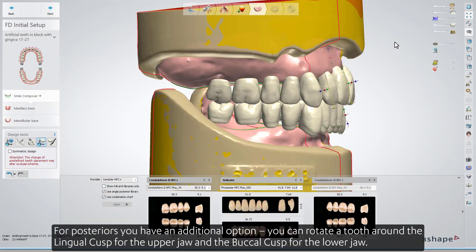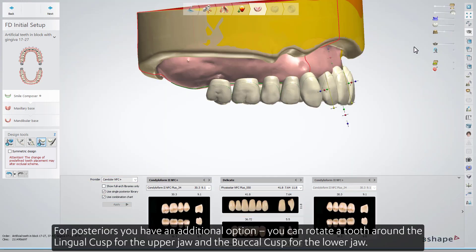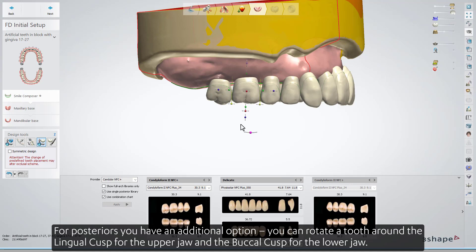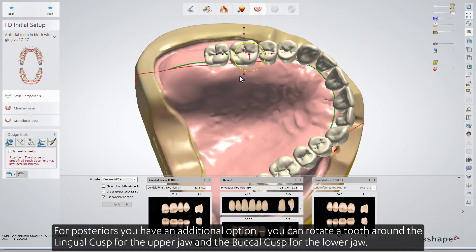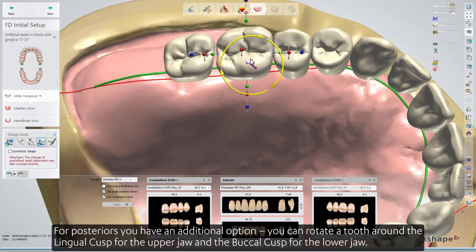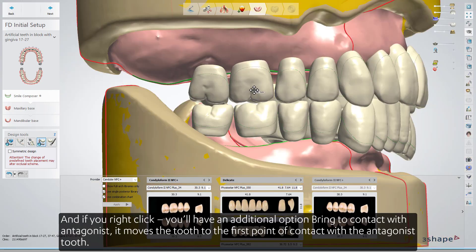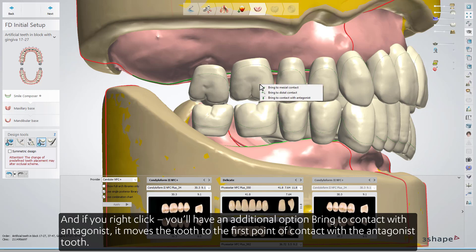For posteriors, you have an additional option: you can rotate a tooth around the lingual cusp for the upper jaw and the buccal cusp for the lower jaw. And if you right-click, you'll have an additional option, Bring to Contact with Antagonist.